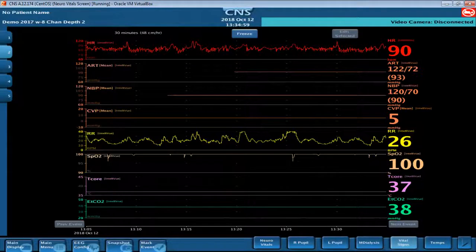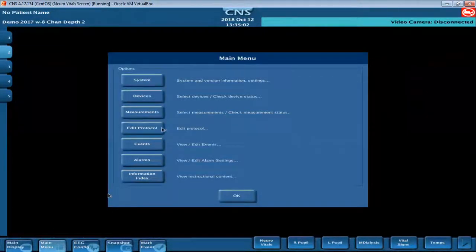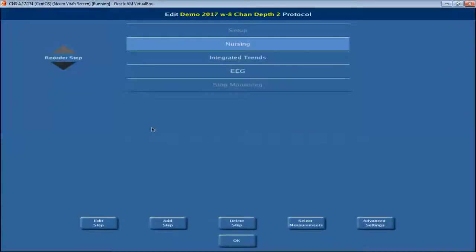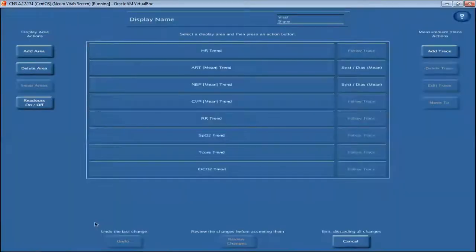So I'm going to do that one more time, just as a review. Main menu. Now we'll do edit protocol. I'm editing that nursing step. And I am editing that particular display. So I can add a trace. I can actually delete a trace.